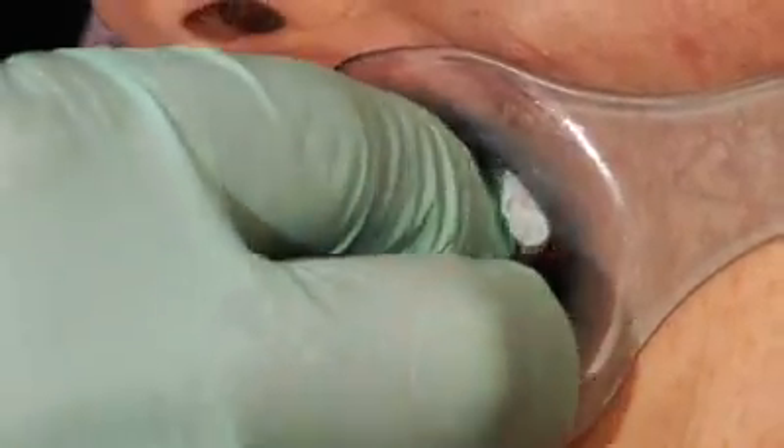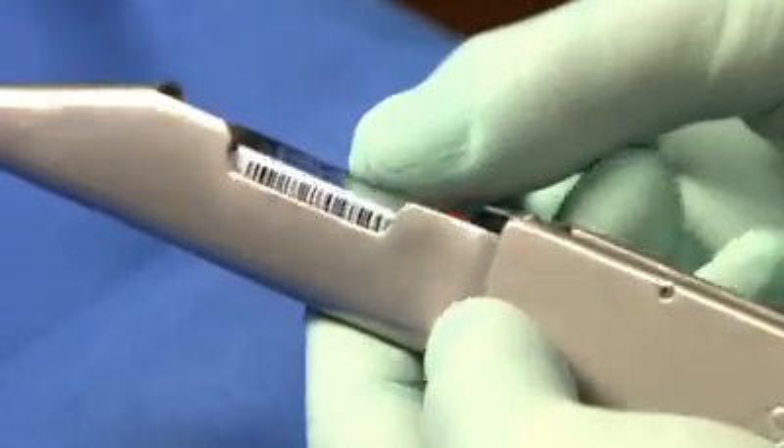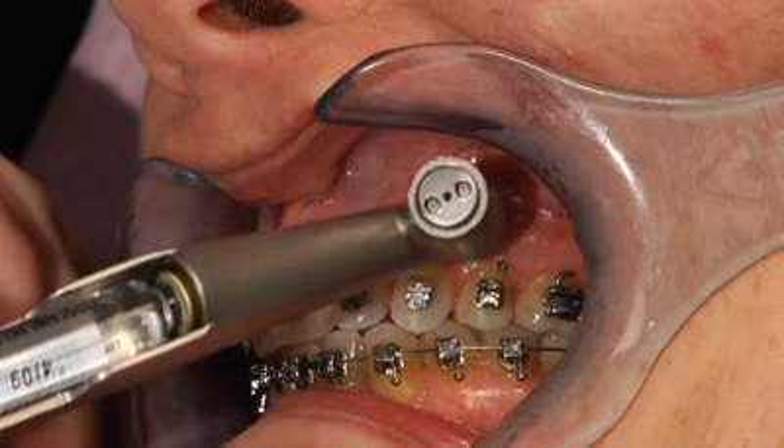Using a needle-less injector like the Syrijet, you can deliver a local anesthetic directly into the tissue. Place the instrument flush against the tissue and administer the injection.